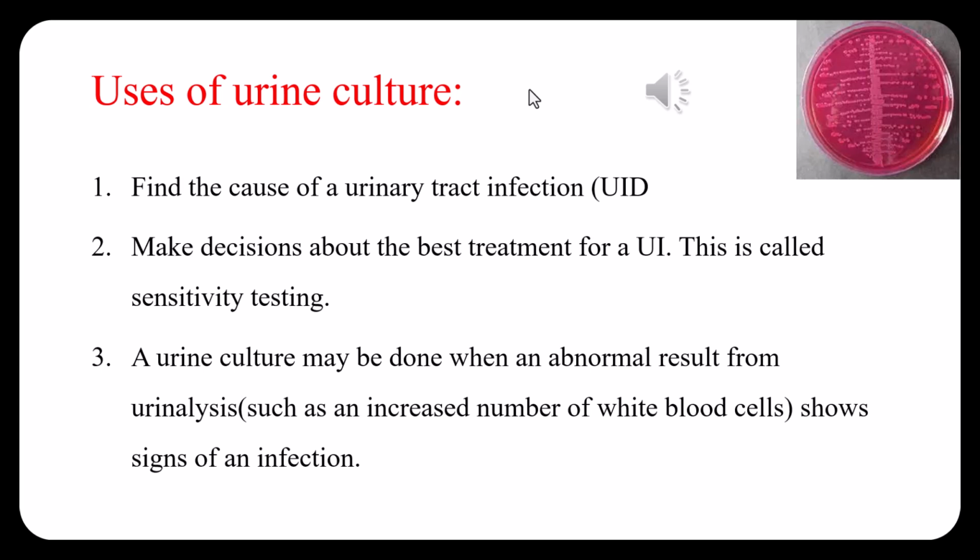This is called a sensitivity test. A urine culture may be done when there are abnormal results from the urinalysis, such as an increased number of white blood cells, which show signs of infection. That is another use for culturing the urine.